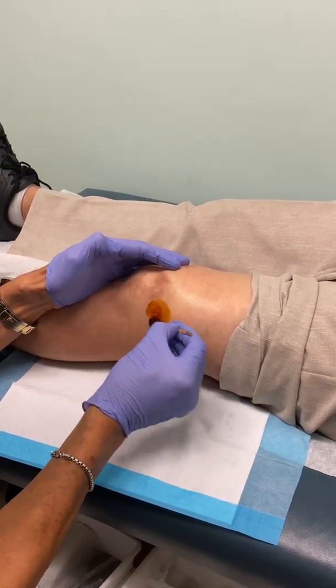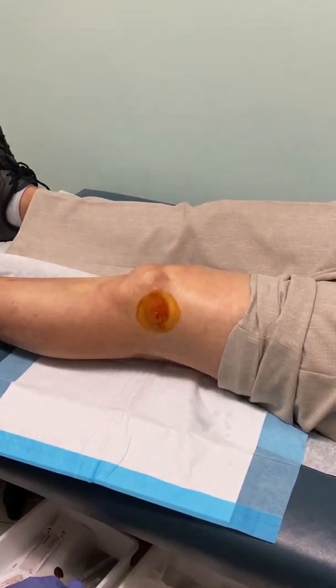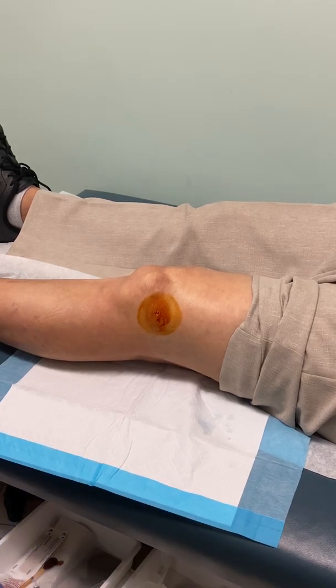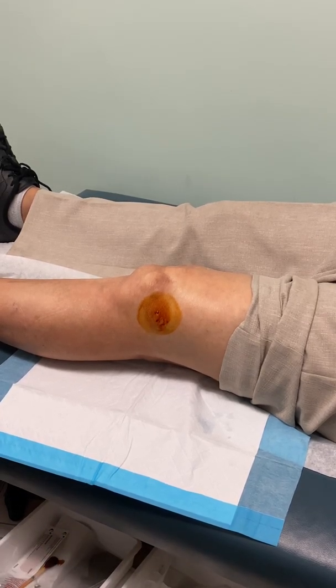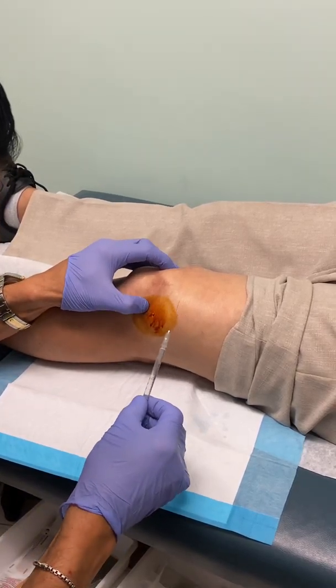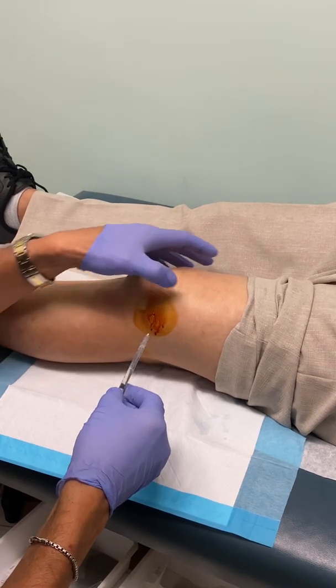So let's clean it up, and then let's hope we can do it. I need a 22 gauge needle. Now you can just go right in with a 22 if you want, or 25 as an option, or a 27 gauge needle. I like to not cause pain.